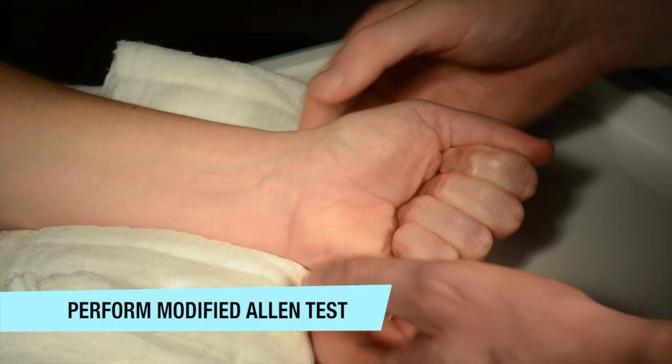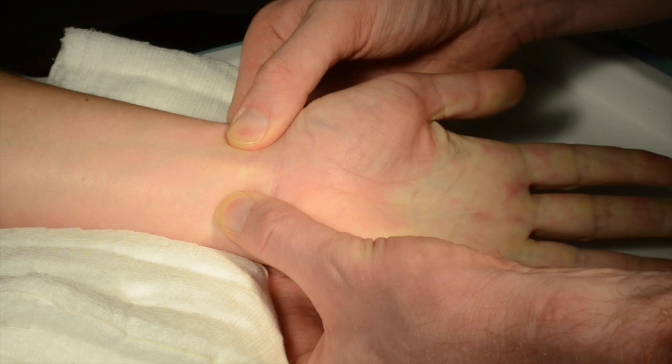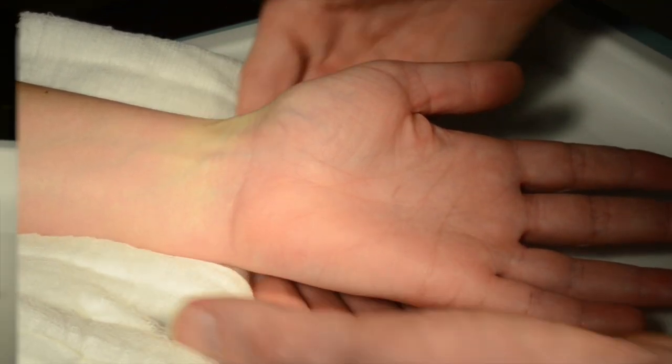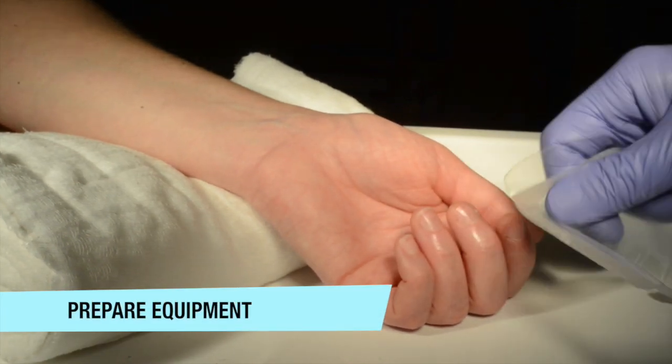Ensure the patient has adequate ulnar collateral supply by performing the modified Allen's test. Note here how you clench the fist and then release the ulnar artery. A positive test is when the blood returns to the hand as shown.